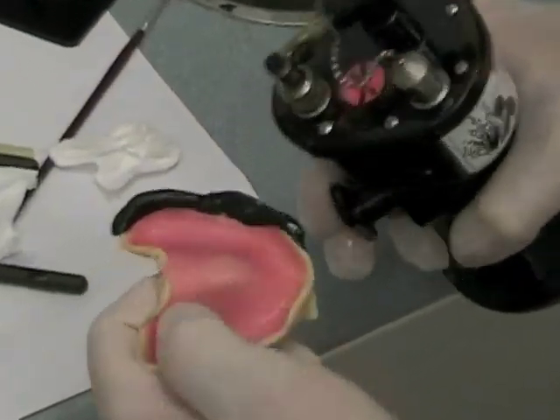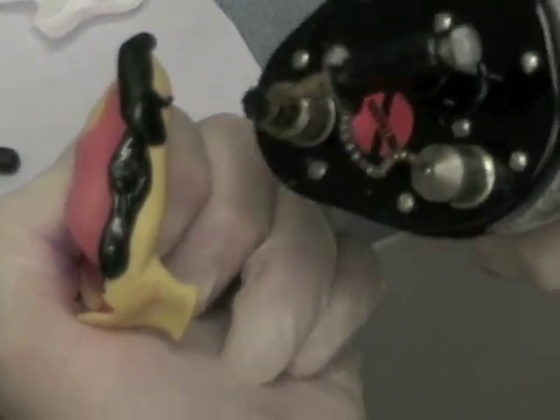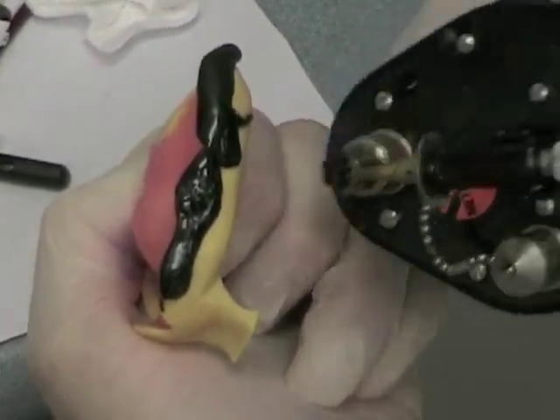When you add the compound to a segment that you previously molded, make sure you use your torch to blend and ensure that you have a glossy, seamless finish between the segments.